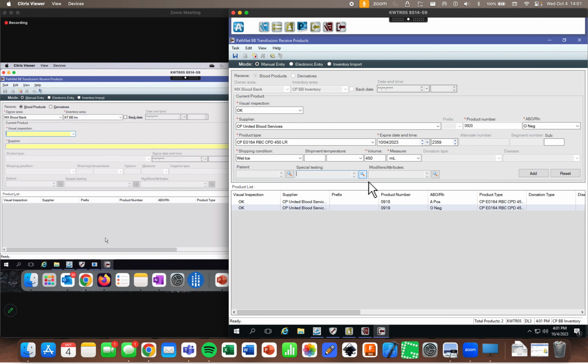But it needs to be on the product that's O negative so that we are able to cross match it to our patient. If I said test 01, I did not mean to. That was my fault. I am so many times tongue-tied this week.